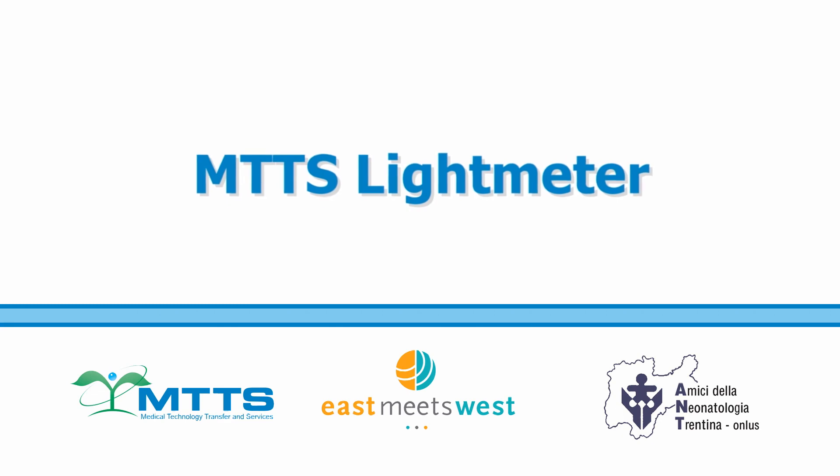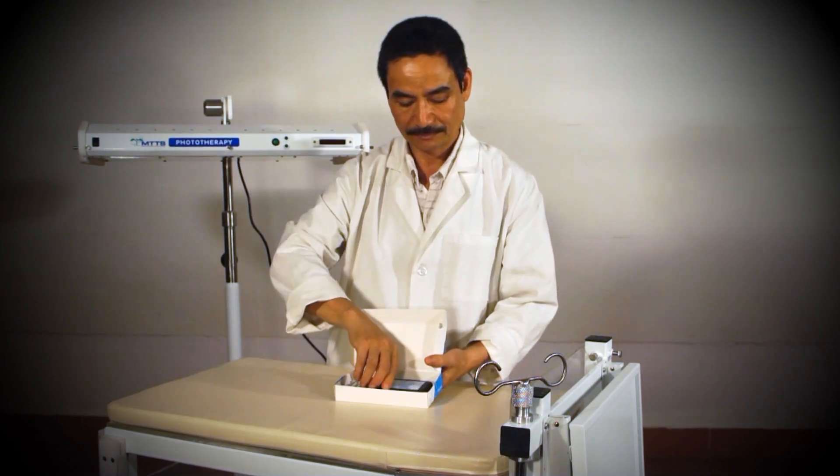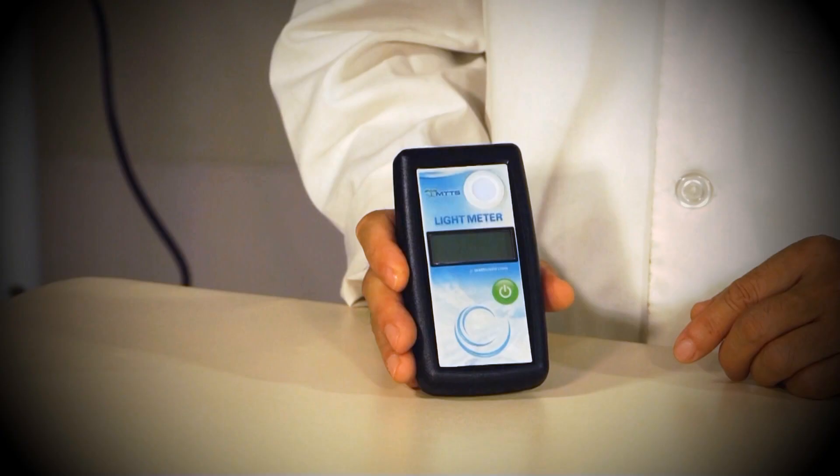The MTTS light meter. This instrument is called a light meter. It measures the intensity of the blue light spectrum that is necessary to treat jaundice in infants.